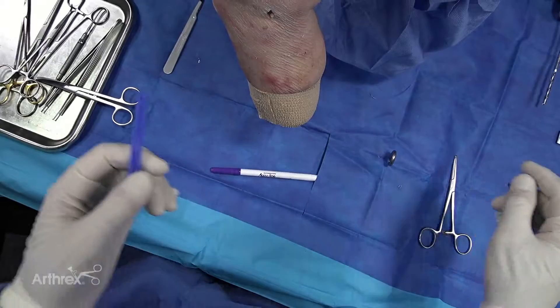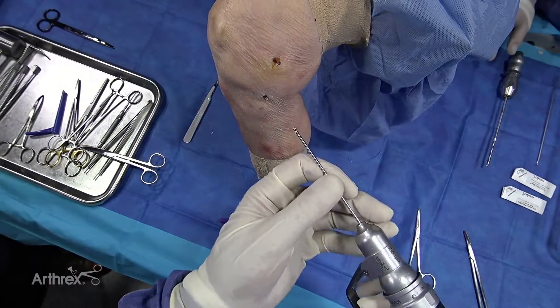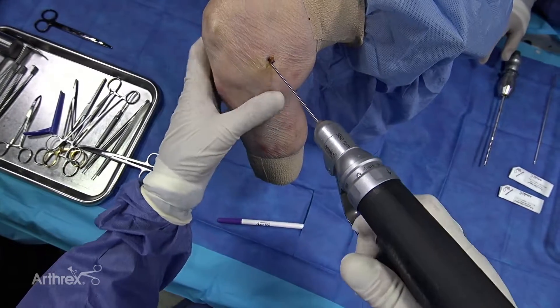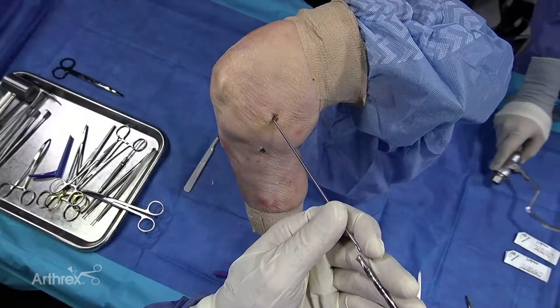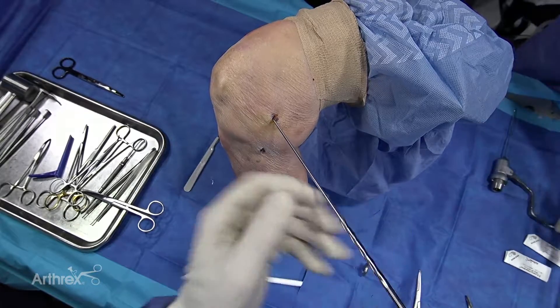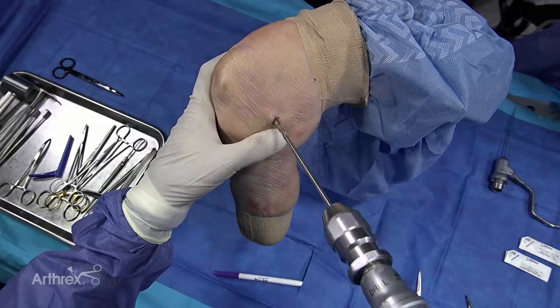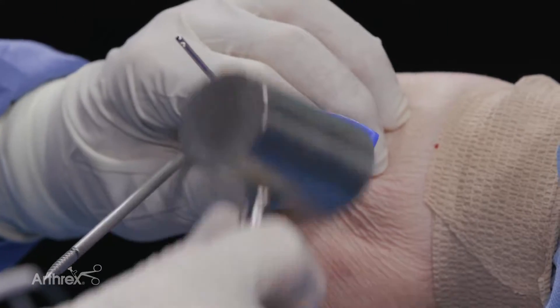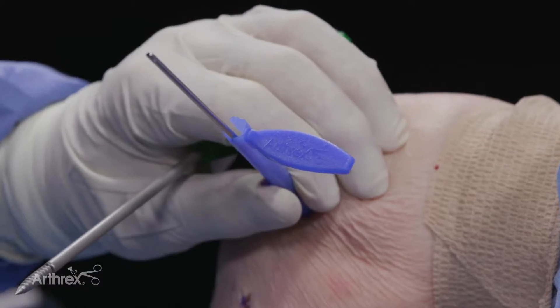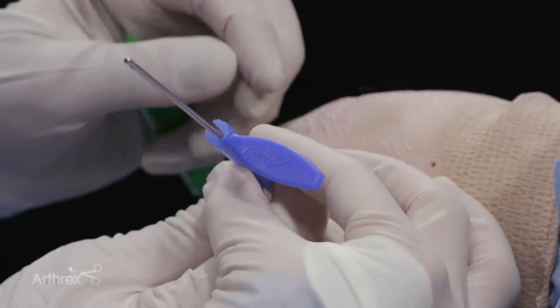Now the next thing you do is you want to use your guide wire — your simple guide wire — and you go right in the medial epicondyle like so. We're then going to use the drill. Now the tricky part is you take the sleeve and you simply put it over and you tap it in a little bit.